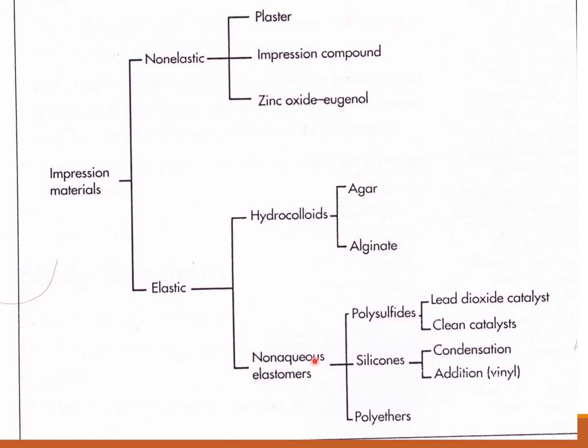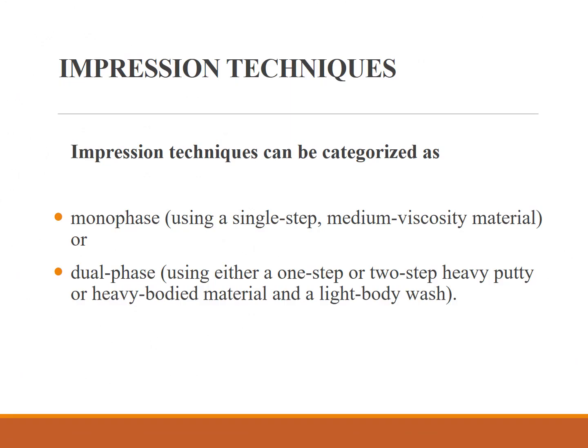Non-aqueous elastomers, which we are using for our FPD impressions, right? Silicones, condensation, addition, vinyl silicone, polysulfides, polyether. We do not usually use polyether, and silicones are there. We are usually using silicones.